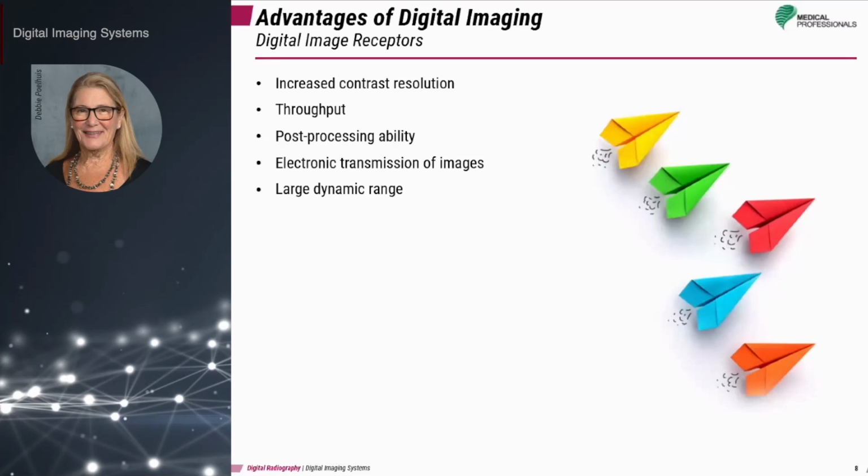It also can promote greater productivity from the workforce because digital imaging potentially allows for fewer steps in the image processing. Departments can increase throughput or serve a greater number of patients during the day.